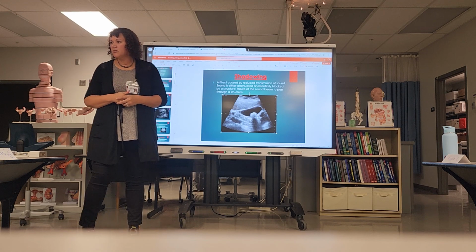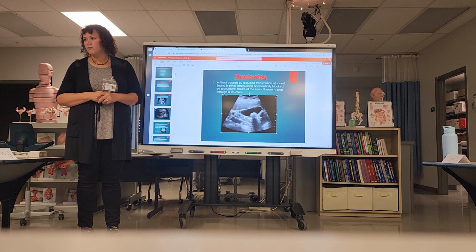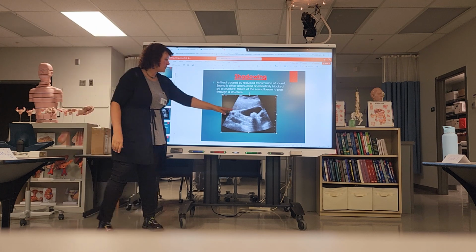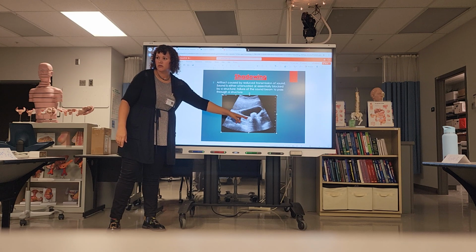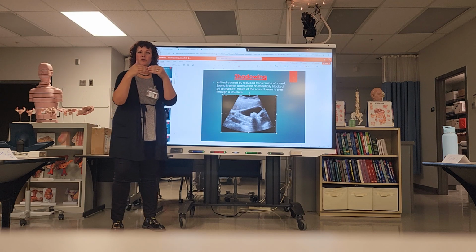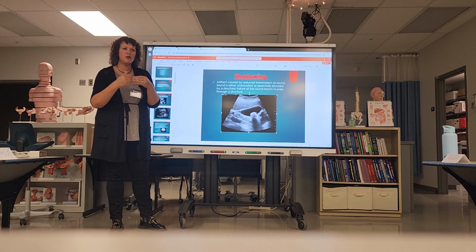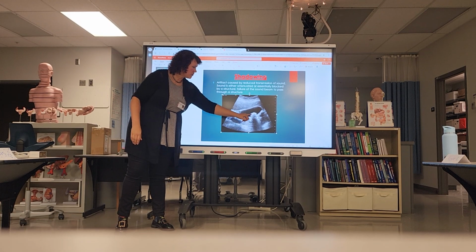Did you have a question? No. Describe this. You would describe this as an echogenic shadowing structure. So we'll get into piecing all these words together and how to describe stuff. So just one step at a time. So this is posterior shadowing.